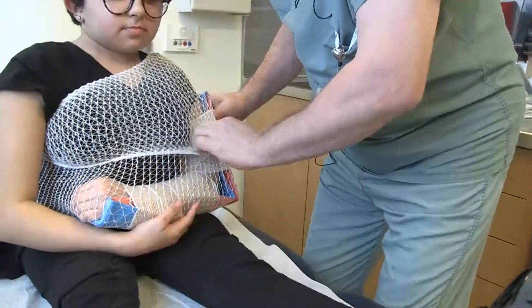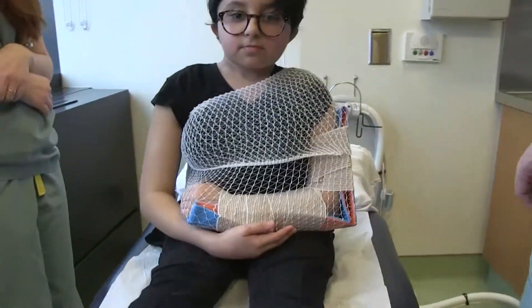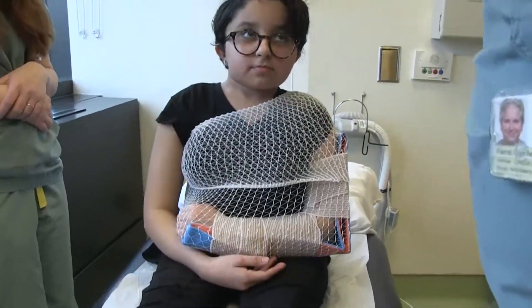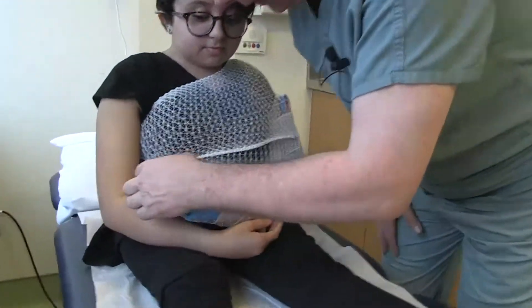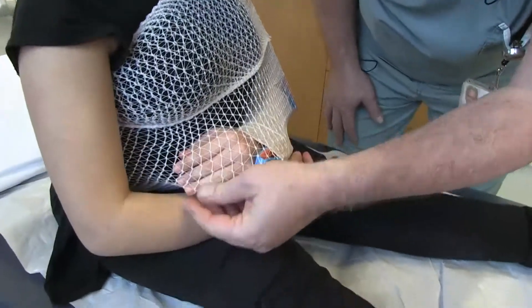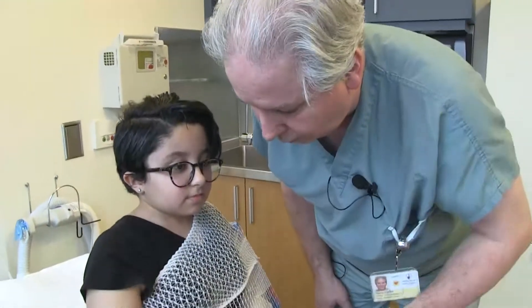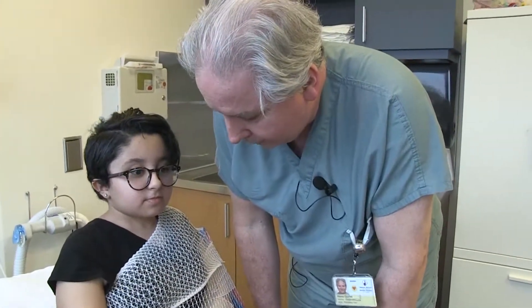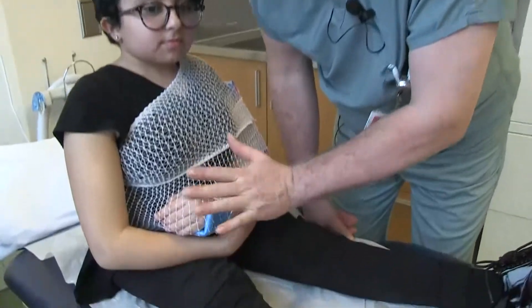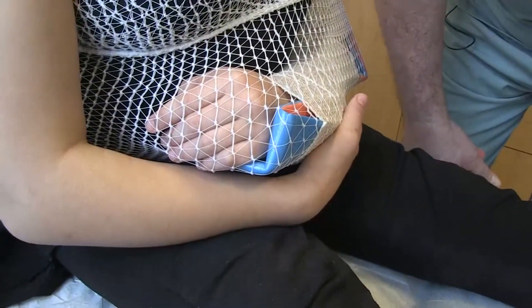It gives a better immobilization. Do you feel well immobilized with this? Are you able to move your fingers? If I touch your fingers, do you feel them? The fingers are warm, so there is no compression on the veins or arteries. The fingers aren't swollen and neither blue nor white. So it should stay that way while we transport the patient to the hospital.